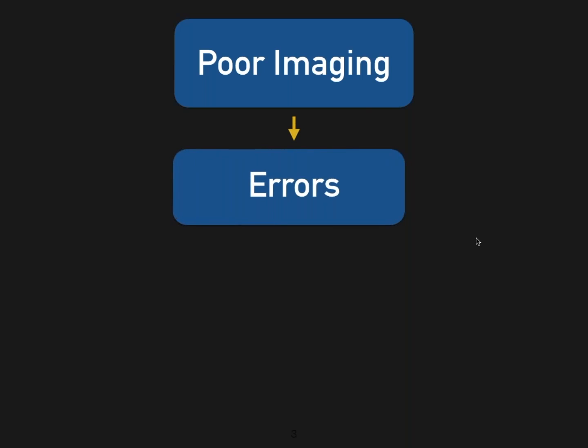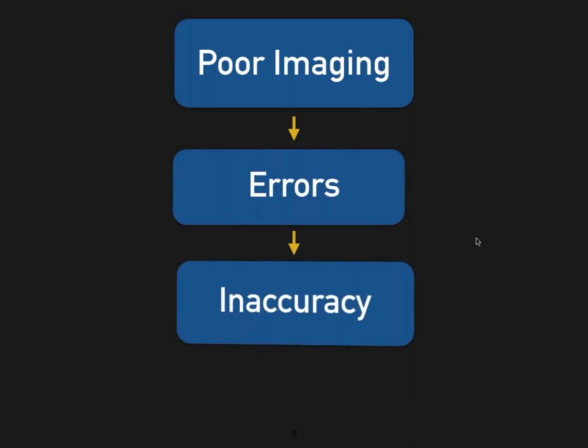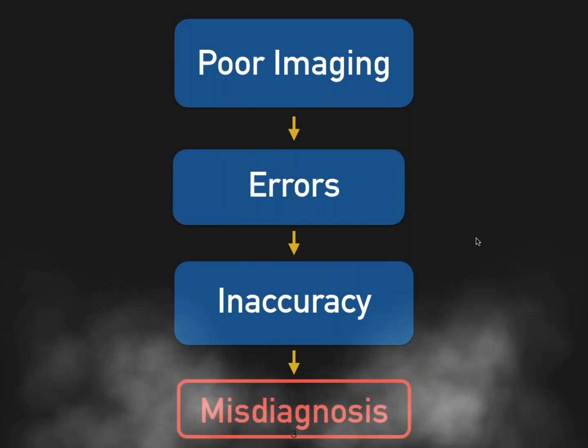As a sonographer and imaging specialist, optimization plays a big role in producing quality imaging, especially when evaluating the heart. Here are just a few tips and pearls that may be helpful for you and that you can apply to your practice. Poor imaging, as we all know, leads to many errors, study inaccuracy, and eventually a big misdiagnosis.